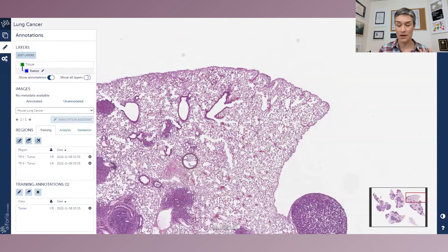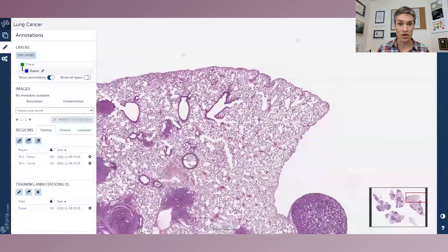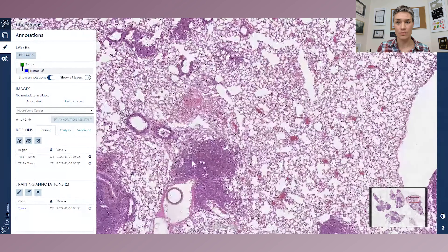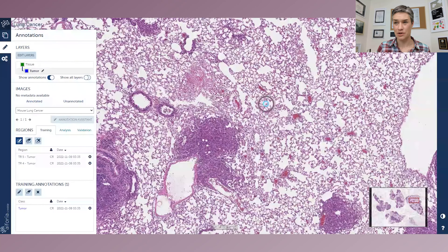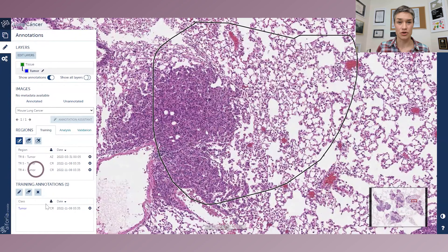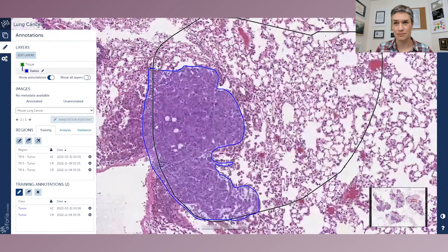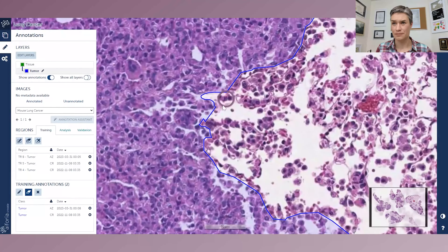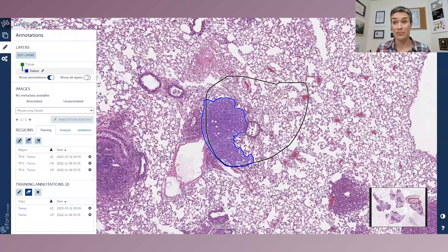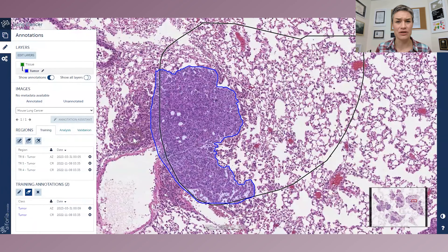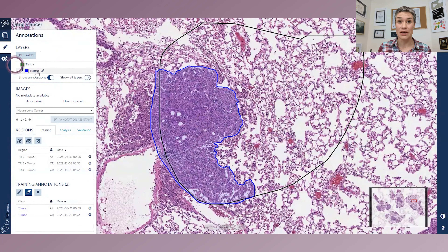Let's switch to our tumor layer. The other layers disappear, because I'm working with a different question now — the other regions are not relevant anymore. We'll make another training region. Here we can appreciate the tumor mass, whereas here is normal lung — we are working with lung tissue. After annotating the tumor precisely, within the training region there is a division into tumor and non-tumor, and from our layer tree we know we look for this division only within tissue.